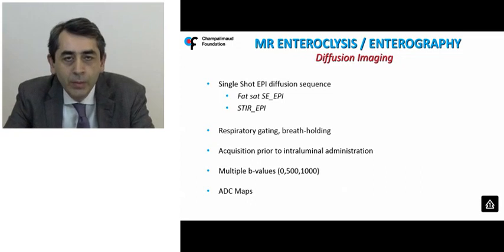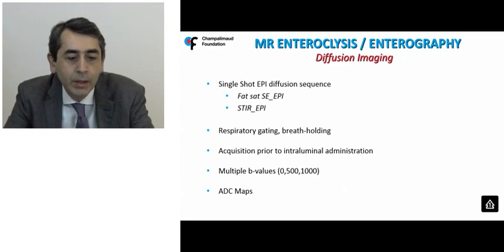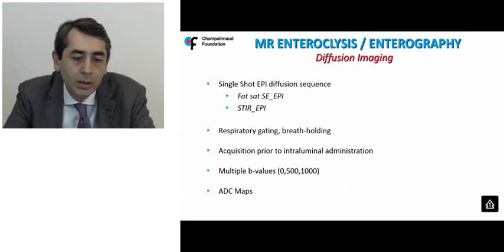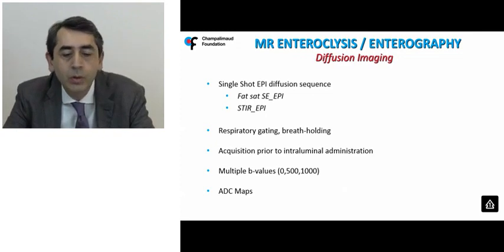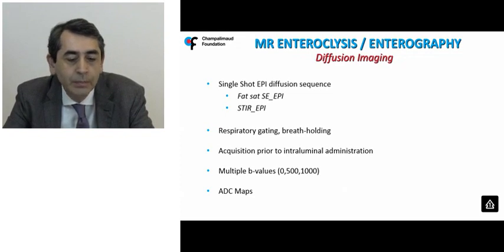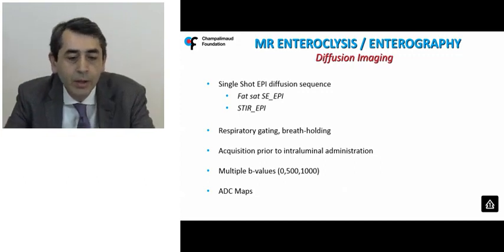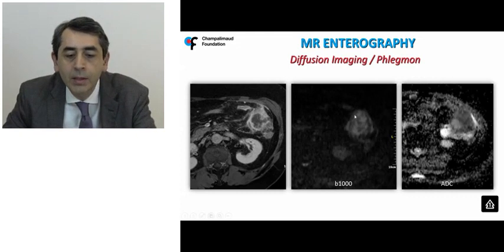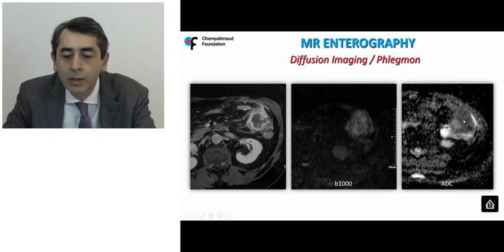The diffusion imaging protocol comprises a single-shot EPI technique, with either fat suppression or an inversion prepulse. Respiratory gating or breath-holding is incorporated to cope with respiratory motion artifacts, depending on the scanner. In MR enteroclysis, the acquisition should be done prior to intraluminal contrast administration to save time. Multiple B-values should be acquired, especially to reconstruct apparent diffusion coefficient (ADC) maps. An example shows a patient with an inflammatory mass — a phlegmon — appearing as bright areas of high signal intensity on high B-value, corresponding to restricted diffusion, confirmed on the ADC map.